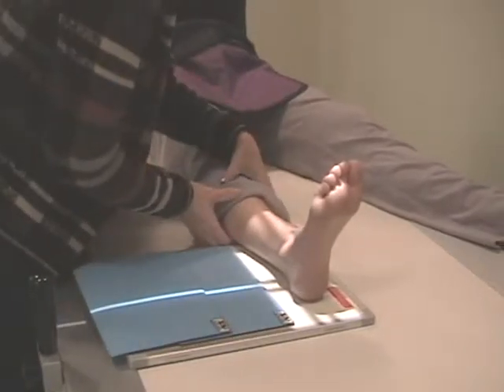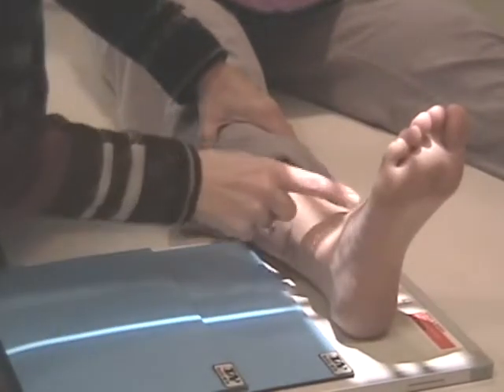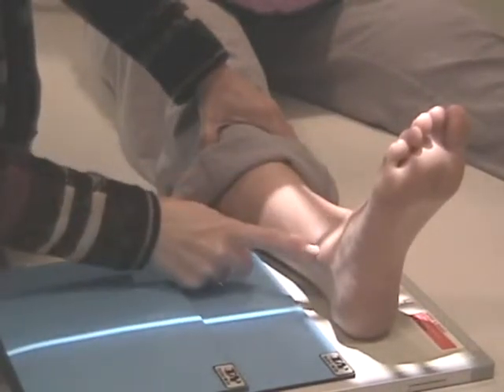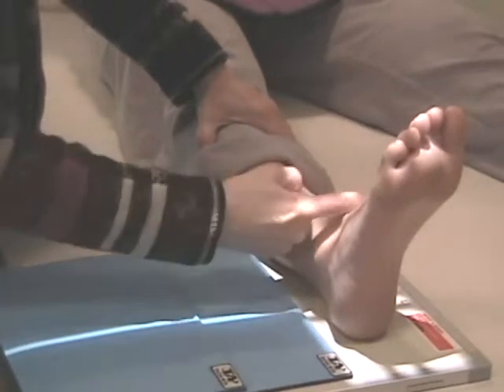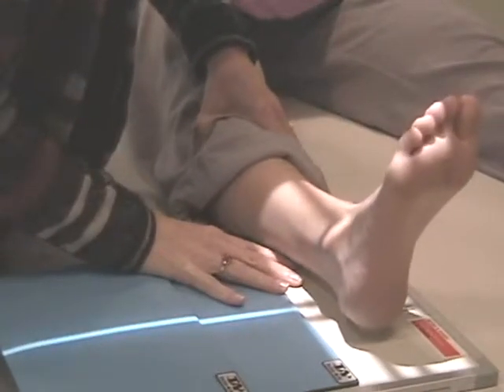So I want my 15-degree oblique. I want the leg coming straight down the cassette, foot flexed, and the central ray coming right down through the fibular malleolus, right at that 90 degrees, exiting to the center of the cassette. There we go.